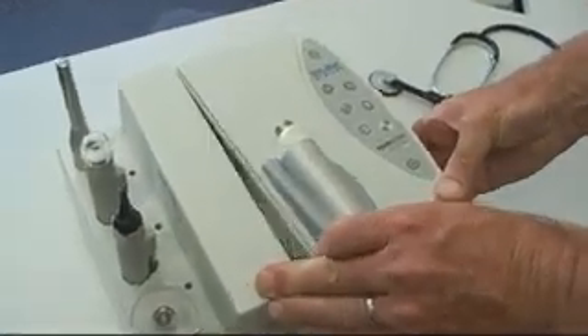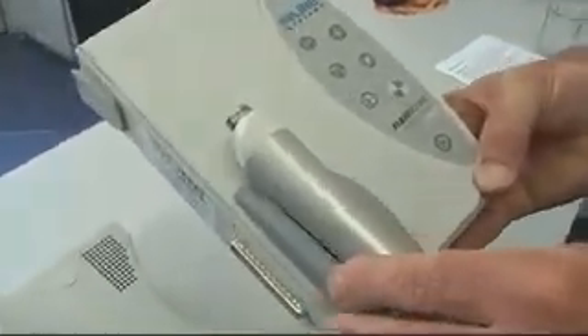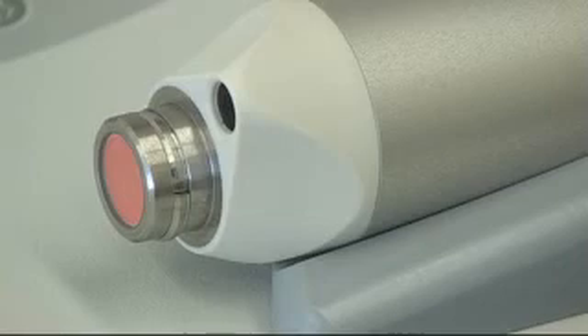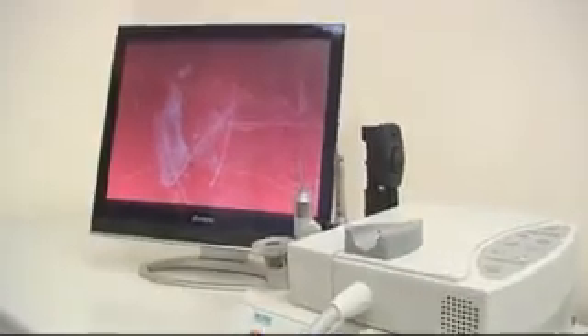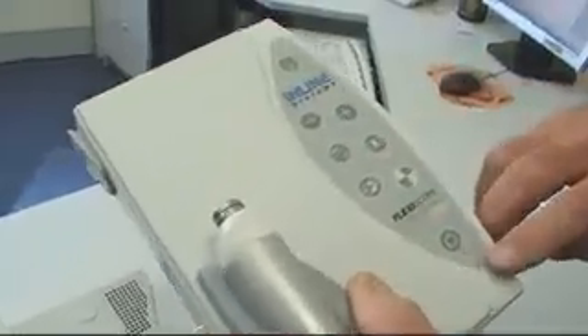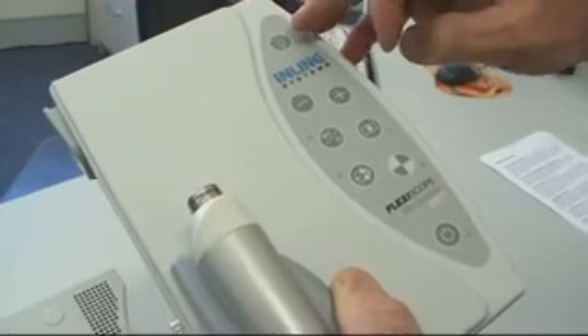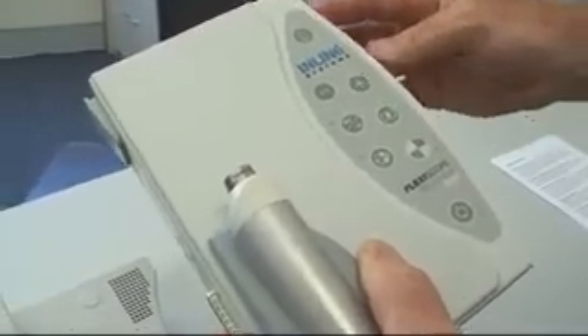The Flexiscope Microvision E&T camera is really six cameras in one and has a unique handpiece design to suit removable snap-on probes. The camera has an automatic white balance and an automatic gain control so you get perfect images every time. The membrane key panel is easy to use, with an on-off switch, a light control button, and various control features for the image quality.